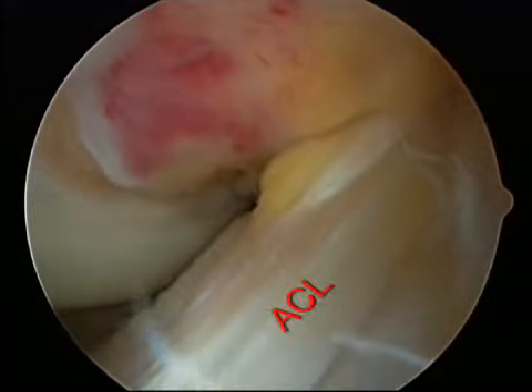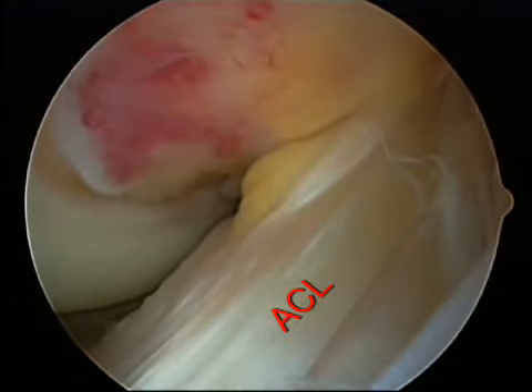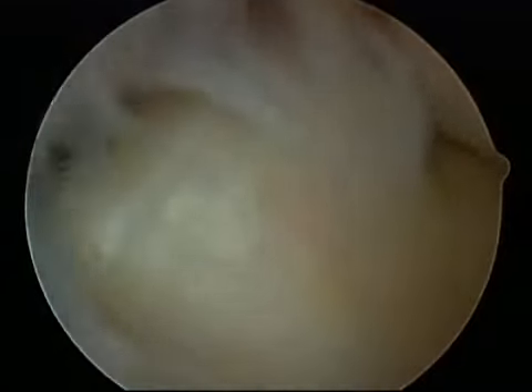This diagonal structure is an ACL, or the anterior cruciate ligament. ACL tears can be reconstructed arthroscopically. The lateral compartment, or the outside of the knee, also has articular cartilage and a meniscus.